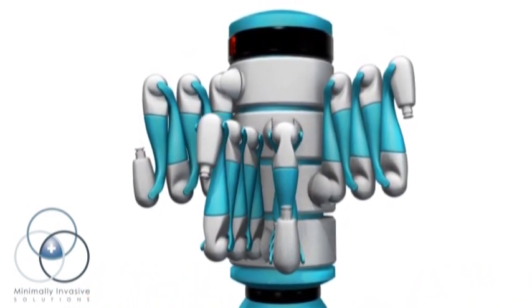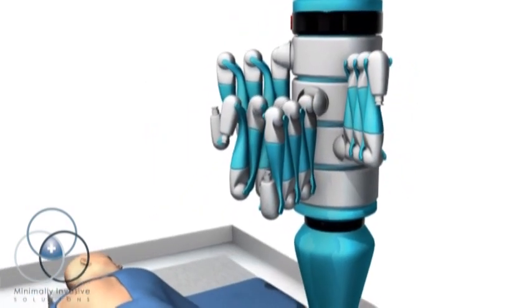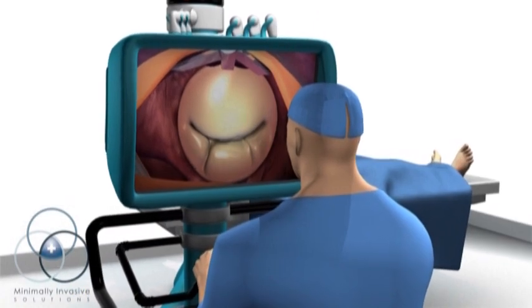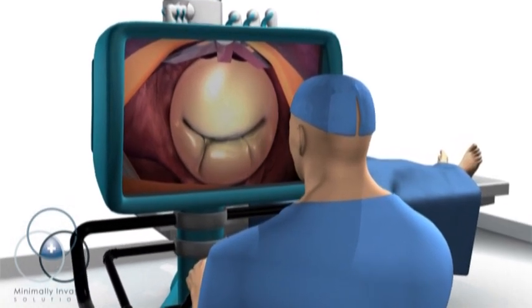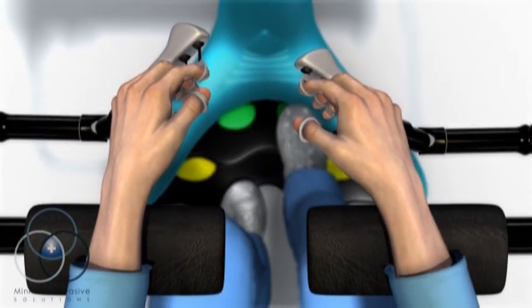three hold instruments and one holds a camera, providing a magnified, three-dimensional view inside the heart. The surgeon sits at a console, controlling the robot's arms and camera using a combination of foot pedals and hand controllers.